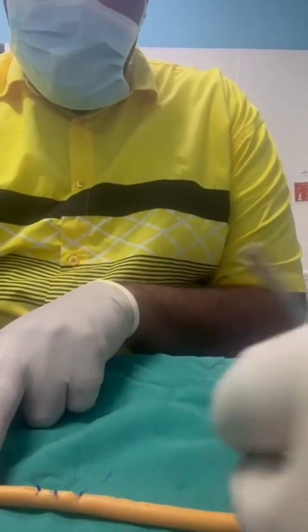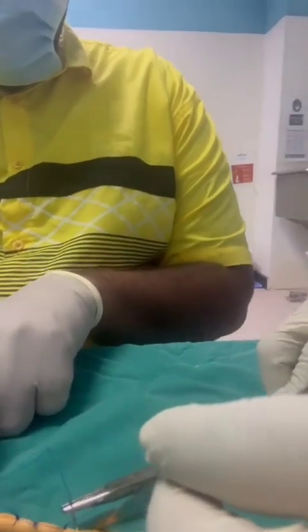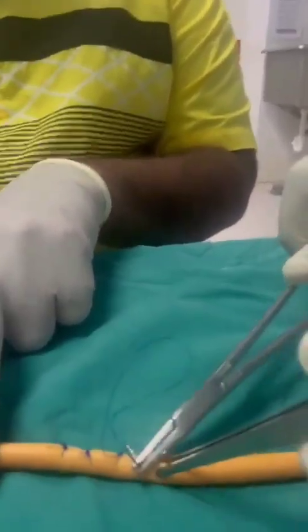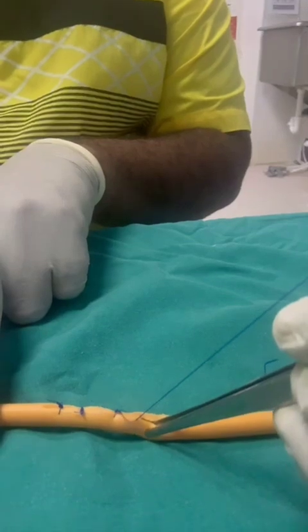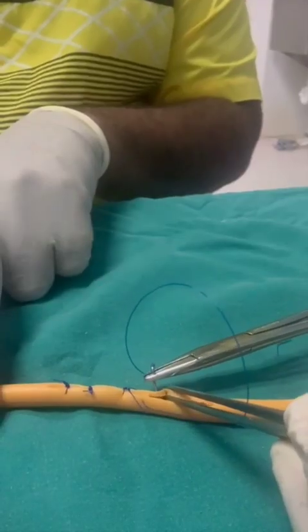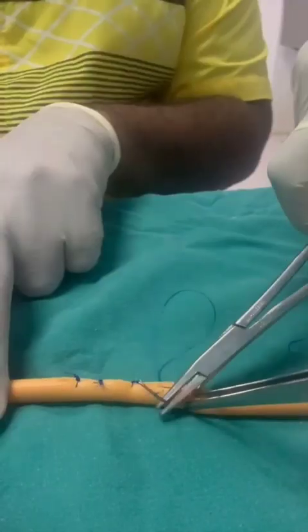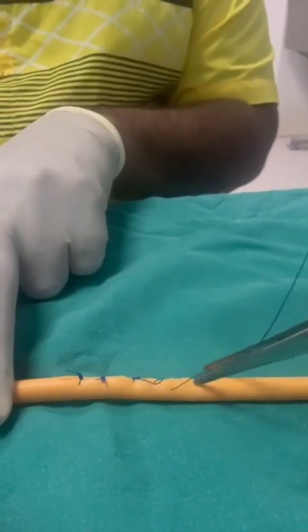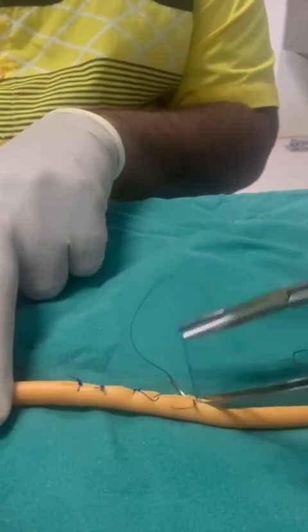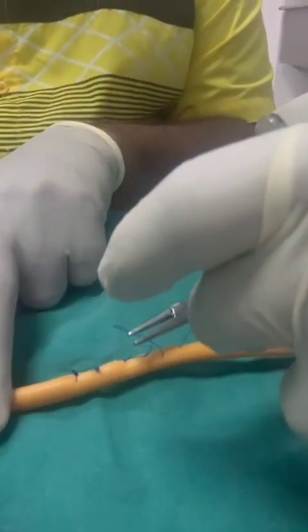What I do this time is make that 90 degrees, rotate the wrist, pick up the suture on the opposite side, 1/3, 2/3, or half. And then I rotate again, opposite side. I rotate, and again through, and then make a knot. Leave a loop, then make a knot.